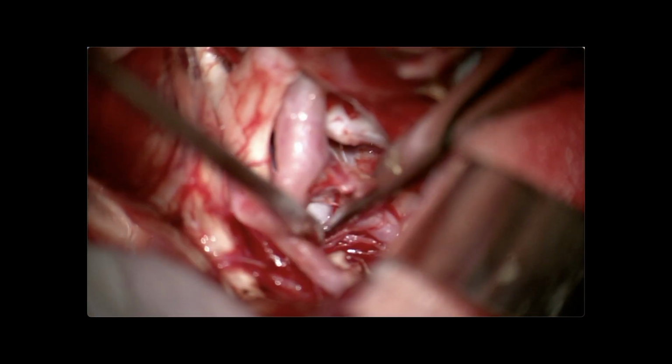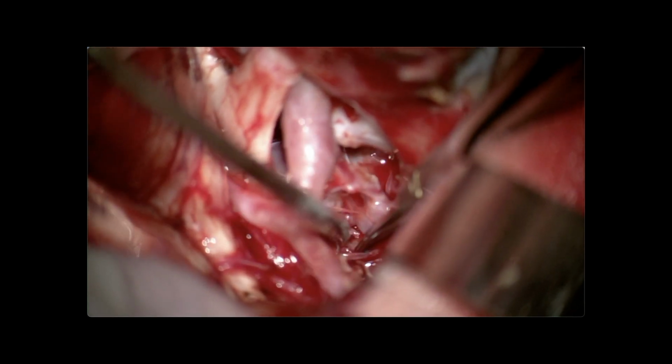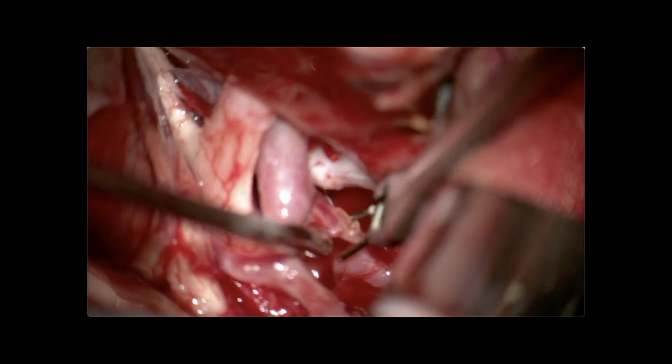Here we see the interpeduncular space. A large aneurysm of the basilar apex is visible. Critical perforating arteries are stretched on the dome of the aneurysm.